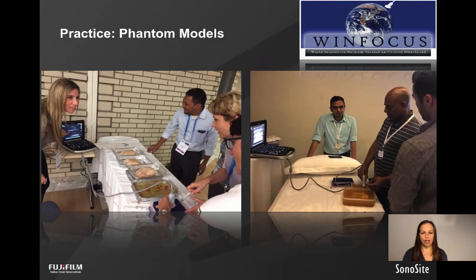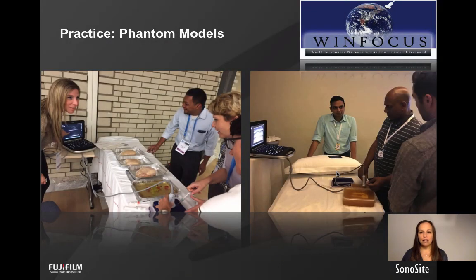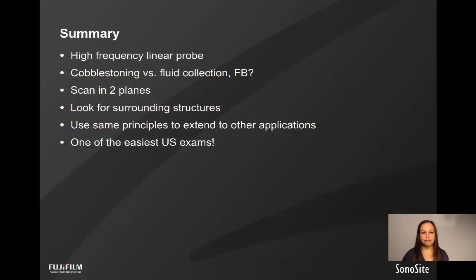So here we are. We had a few courses with WinFocus where we had various gelatin and chicken models. And here are those gelatin models. It's helpful to practice to identify what these abnormal patterns are on ultrasound before actually scanning on real patients.